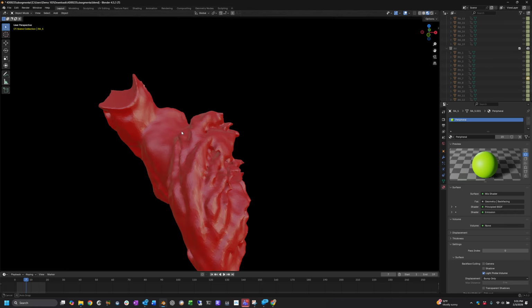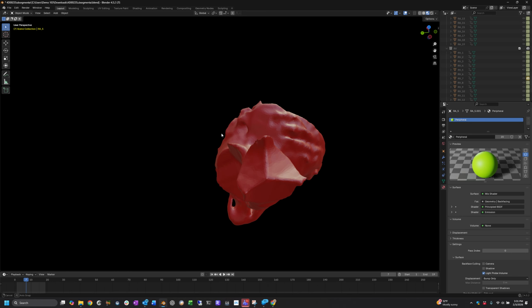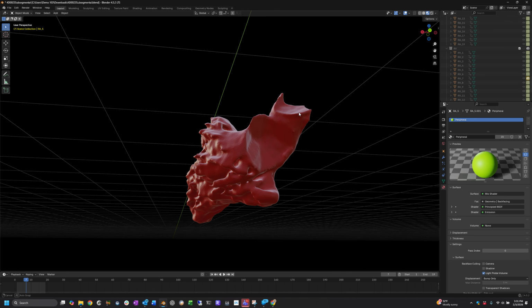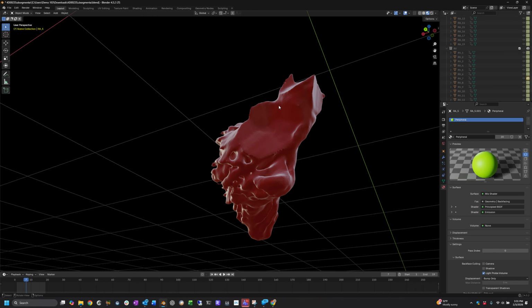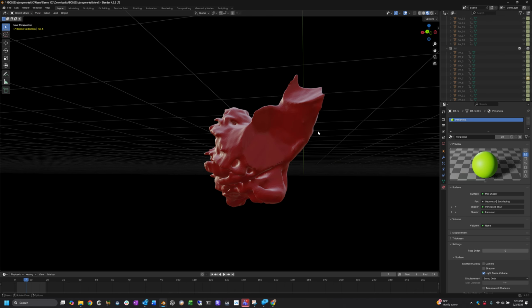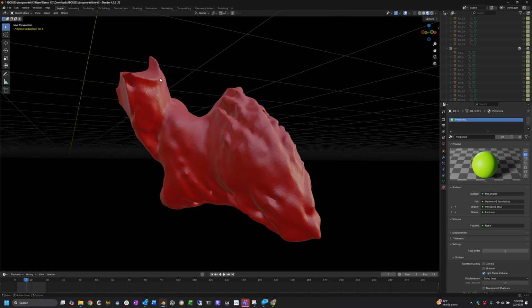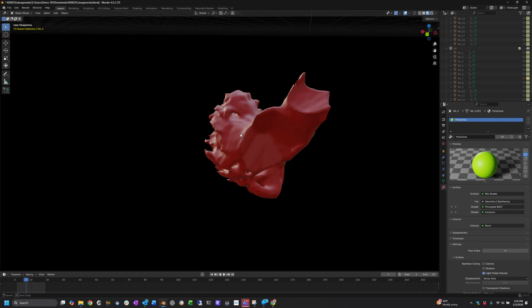And again, I can see where I could take out some there, all the way down to here, and here. I think what we need to do is pick some sort of an angle. If we say that the plane is right here, a 45 would take us from this point up. So 45 would cut about like that. It may be 30 degrees, maybe, but we probably need to pick an angle and then create some education that trains specifically how to do that.